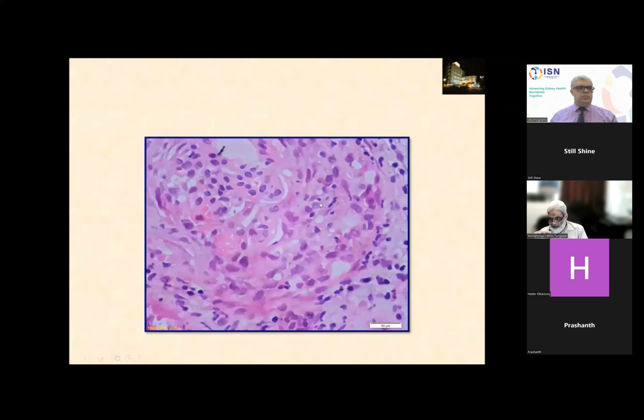And here in this photo, this is a section in a glomerulus, and the glomerulus here is remarkable for a huge circumferential crescent. Here is the boundary, the Bowman's capsule, and all these cells are cells of the cellular crescent, and the glomerular tuft is just restricted here to this segment. And in this tuft, we notice a focal segmental necrotizing glomerulonephritis, and this is a very clear example of ANCA-associated glomerulonephritis with focal necrotizing glomerulonephritis and the huge cellular crescent obliterating the capillary function.